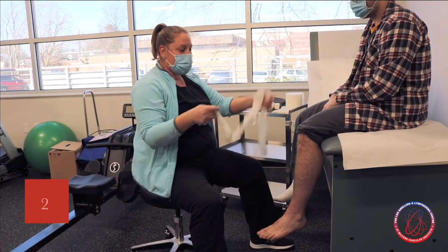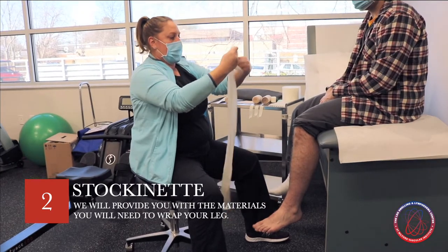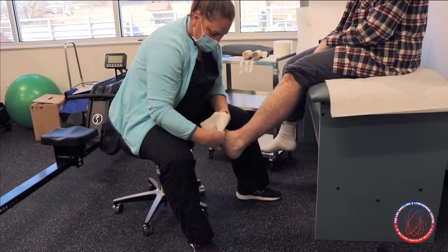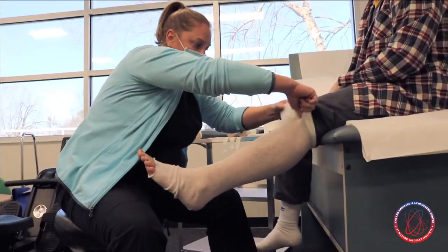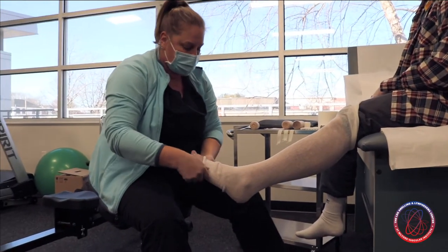The first layer of the compression bandaging is your stockinette layer, which I will provide for you. Just like its name, it looks like a big stocking that pulls up to just above the knee and comes down to the toes.